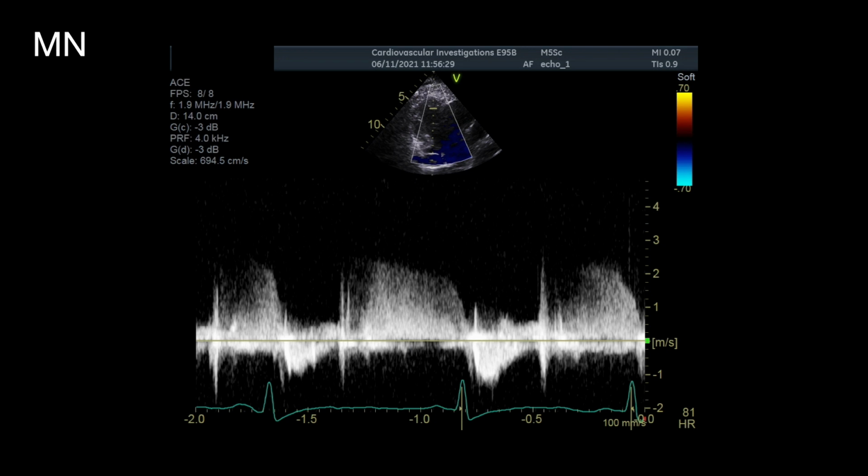And then above the baseline, they've captured with continuous wave Doppler that PR jet. So if you wanted to measure your MPAP and the end diastolic velocity, you can do it here for the pulmonary artery diastolic pressure.